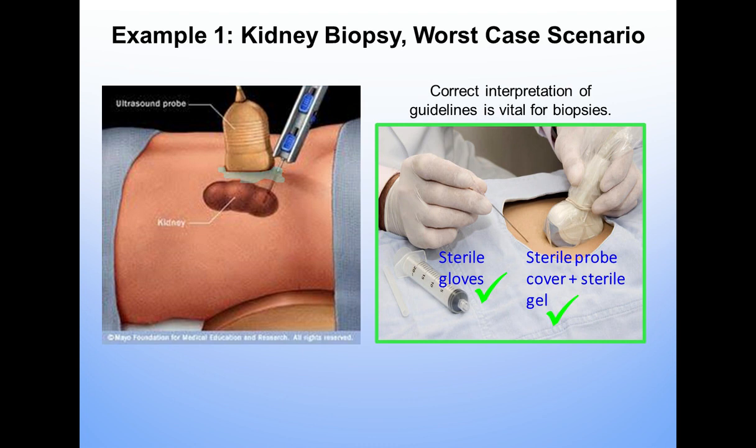So, of course, what you should do is use sterile gloves. This would be a sterile field procedure. You should use, obviously, sterile gel and a sterile probe cover, and you need to reprocess that probe appropriately as well.